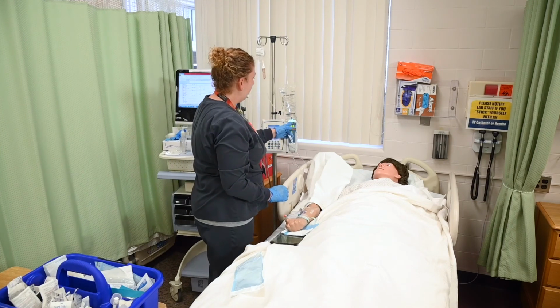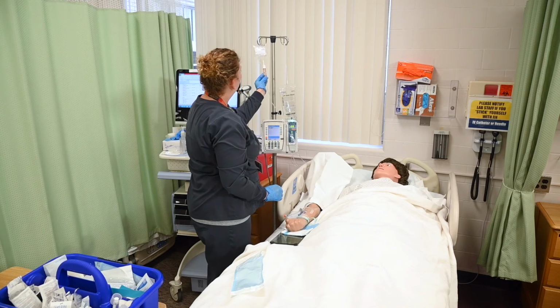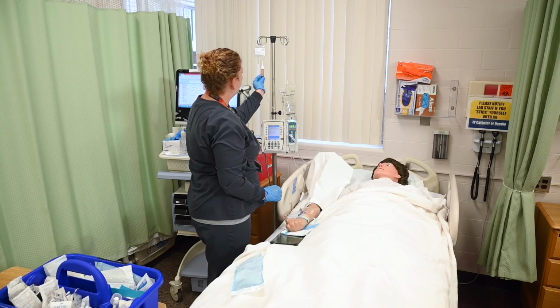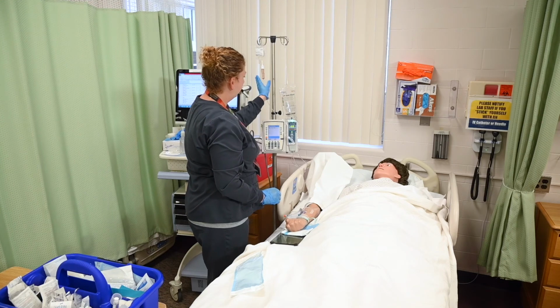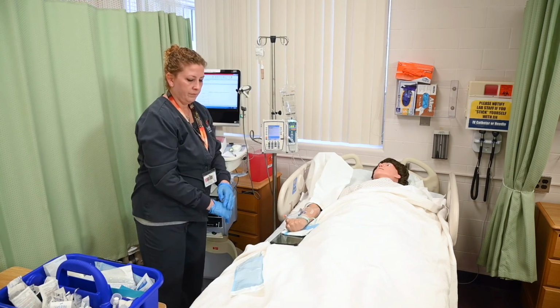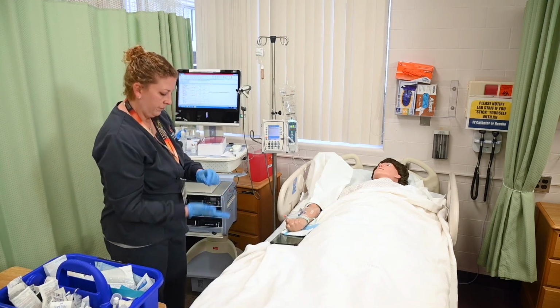I'm going to watch that the green light is on the IV pump and that I see my IV Piggyback medication dripping in the drip chamber. Label the secondary tubing and dispose of used supplies.